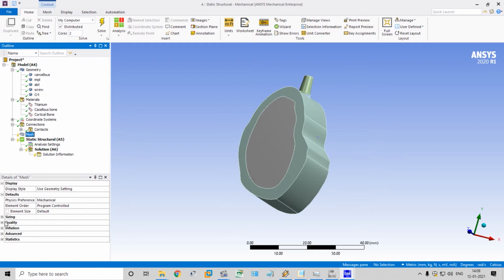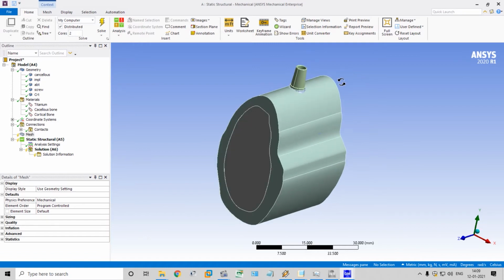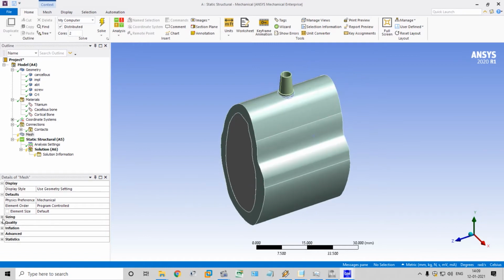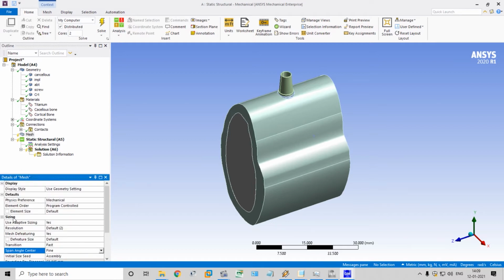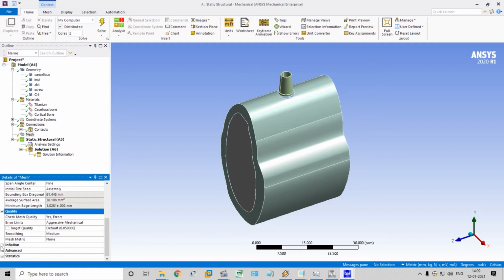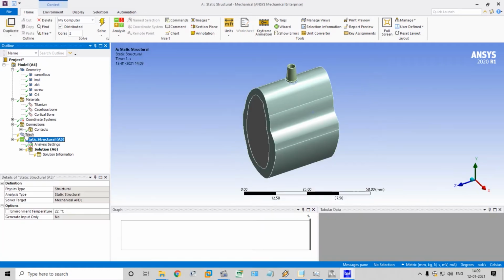Mesh, important factor. The entire model will be converted into small elements. According to this, we have to assign what size it will be. Quality, no inflation, same as controlled by software. Statistics. Okay, static structural, it's a final result file.